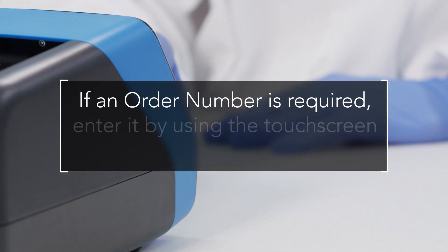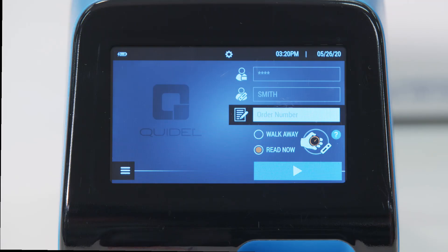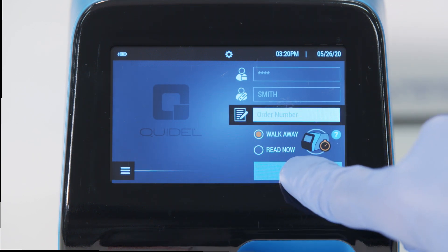If an order number is required, enter it by using the touchscreen or integrated barcode scanner. Ensure that SOFIA2 is set to the desired mode — ReadNow or, in the case of this demonstration, walk-away mode — and press the start test button.